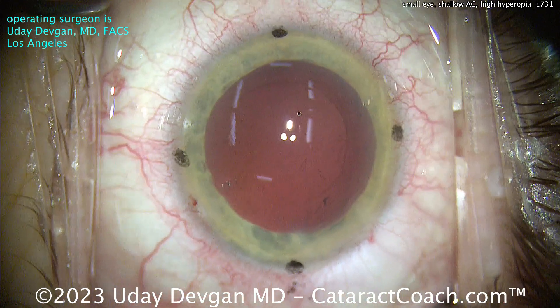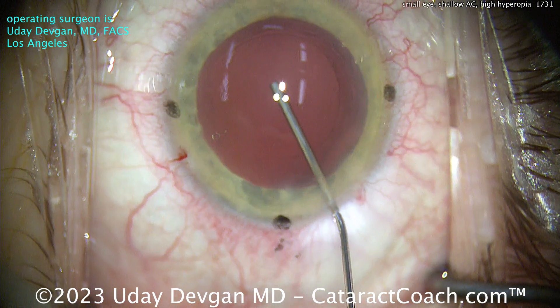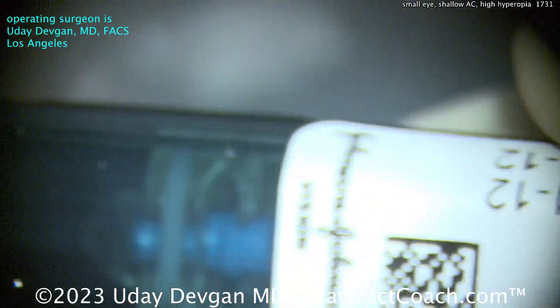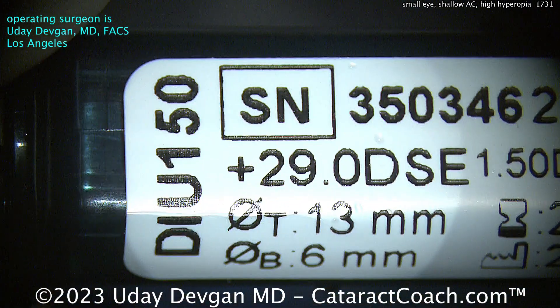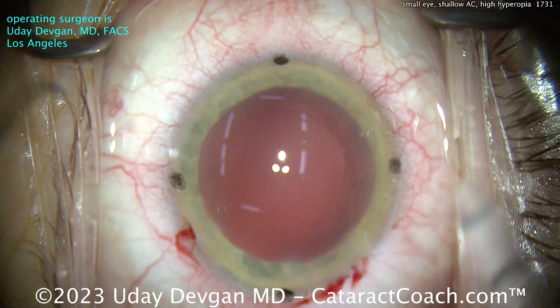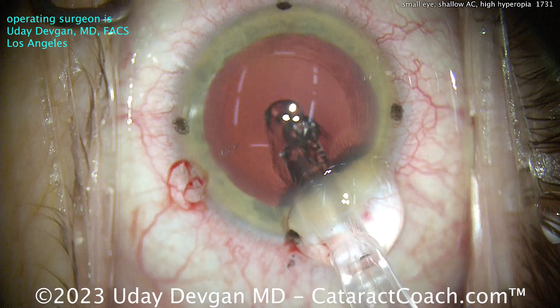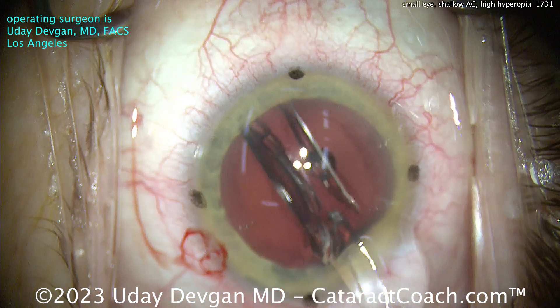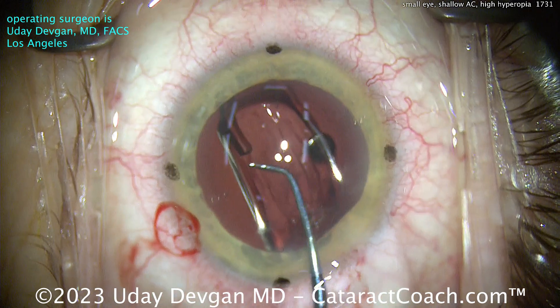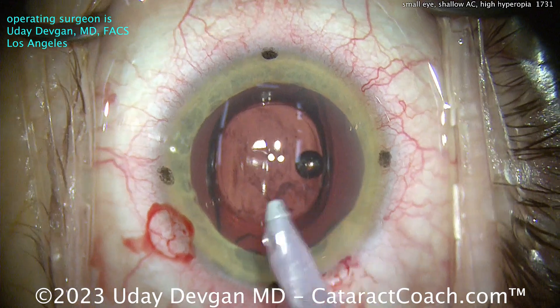So there we go — nice, clean capsular bag. Filling the capsular bag with our cohesive viscoelastic, and we'll get our IOL delivered. Part of the reason we want a slightly larger incision — the 2.75mm — is that this is a very thick lens. 29 diopters is about 50% thicker than our average 20-diopter lens. You do need a slightly bigger incision, just a fraction of a millimeter, in order to get the lens in and keep it in very good shape. You don't want a crack or crease in the lens from trying to shove it through too small an incision. The toric Eyhance DIU-150 is now delivered.